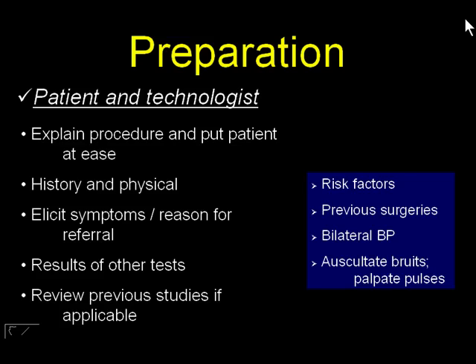We may or may not perform a brachial artery blood pressure. We do not happen to do that routinely. I know there are some laboratories that do that. We have an algorithm in place that calls for the performance of a bilateral brachial artery blood pressure. And of course, any patient who presents with symptoms referable to the posterior circulation, or any patient, of course, that's referred for asymmetric bilateral blood pressures would get an evaluation in our lab and also get an evaluation of the bilateral subclavian arteries as well.